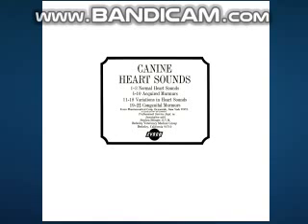Sinus arrhythmia, a normal variation in cardiac rate, is related to respiration in dogs. It is heard in most of the sounds recorded. Listen to the normal heart sounds of a dog heard over the mitral valve region near the left 5th intercostal space at the sternal border.